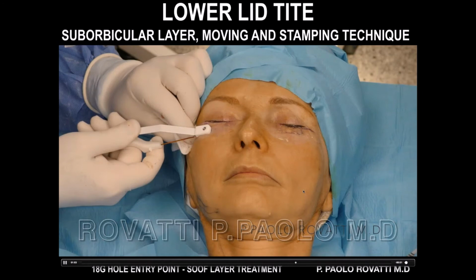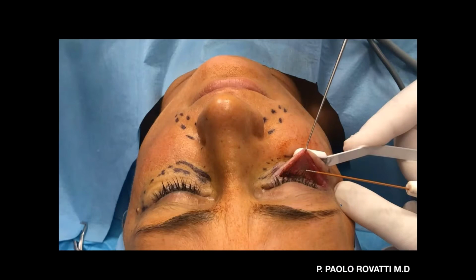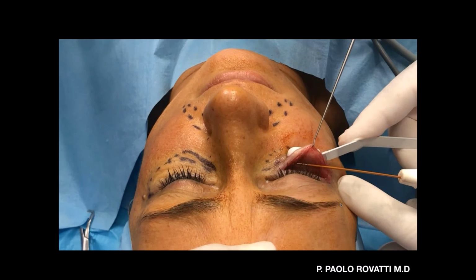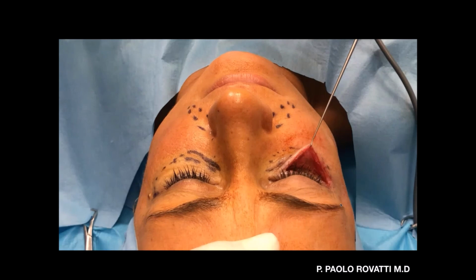Now, let's go ahead. I want to show you, during a lower blepharoplasty, what is happening on the muscles when I'm treating. Sorry for the lights, it's not so beautiful, but you can see that now I'm treating, and you see just a little contraction of the muscles, just as when you do it with the electric coagulator. Some of the same things. You don't damage the muscle, you don't have a big contraction.